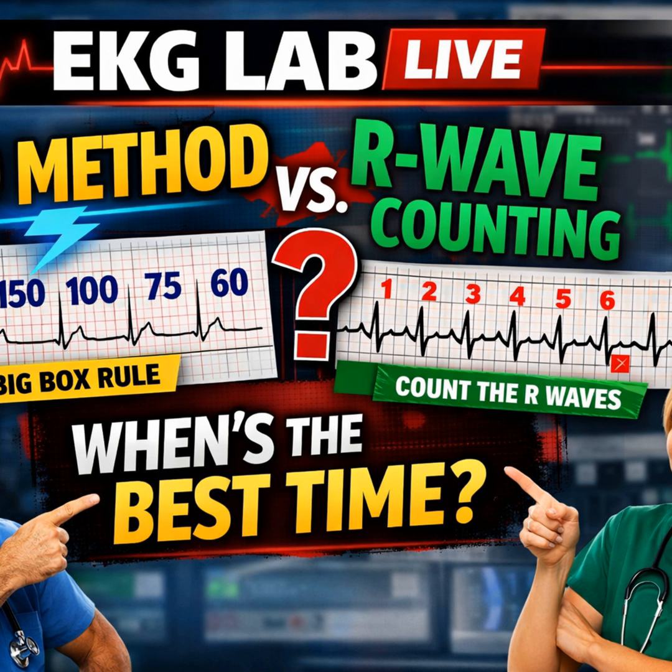My position is that the strip method, counting R waves in a 6-second strip, is just the more practical, more robust tool. My whole argument is that the big box method works in a textbook where the heart beats like a perfect metronome. But in the messy reality of the ER, especially with those irregular rhythms our sources mention like atrial fibrillation, the big box method just falls apart.